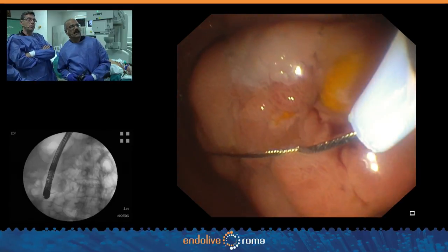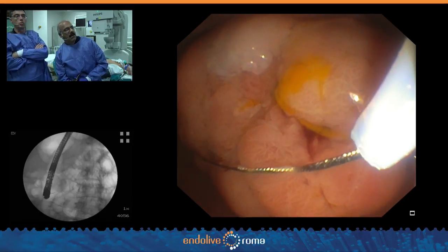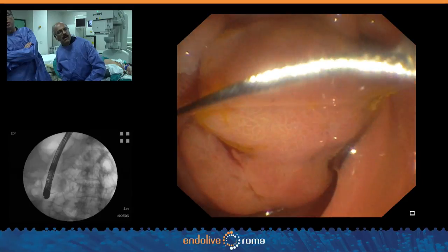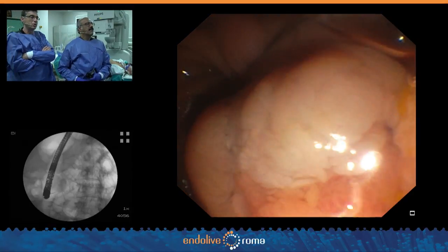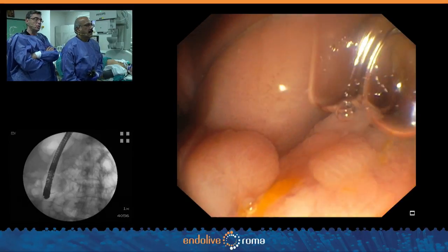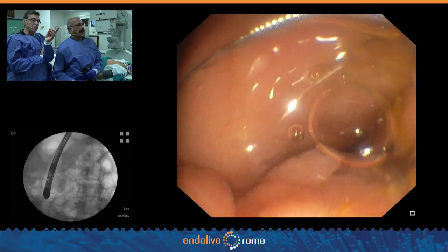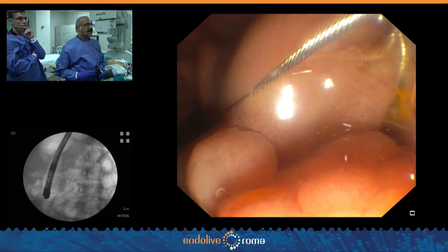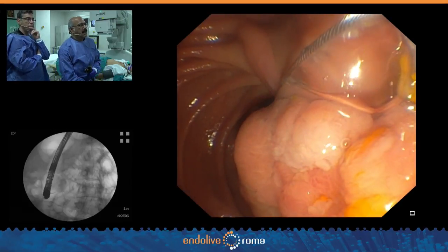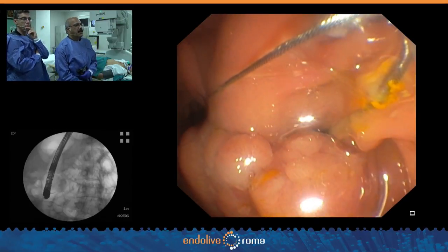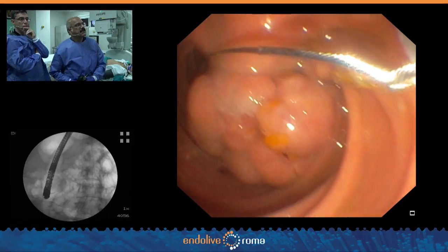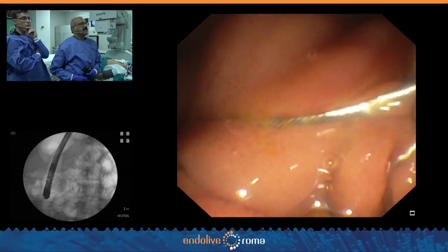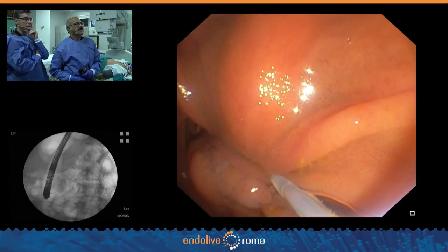Let's see if we got the whole thing. On the left part it's okay, but on the right part maybe not fully captured. To get at the pedicle properly, I'll move it from here. One of the things I'll do is lift it up a little, then move my scope up and down so that the snare wriggles, then partially close it. Can you pull it back gently? What do you think, Mark? I think it's okay — if you push the catheter. I think we need to catch it a little more in the back, as we have more space on the pedicle there.